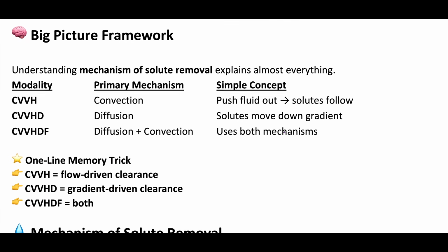Big picture framework. Understanding the mechanism of solute removal explains most of the differences between these continuous renal replacement therapy modalities. We actually should have said this earlier, but if you have not watched the individual episodes on CVVH, CVVHD, and CVVHDF, we'd highly recommend you go back and do it, unless you already have a good understanding of these, because those are deep dives on the individual CRRT modalities. This is going to be an overview of them, so it might be confusing if you don't have enough foundational understanding of these.